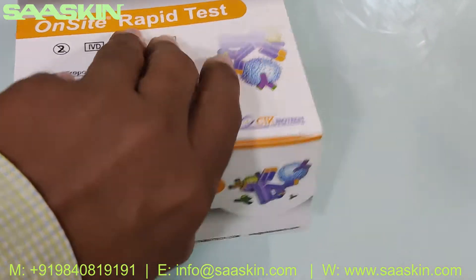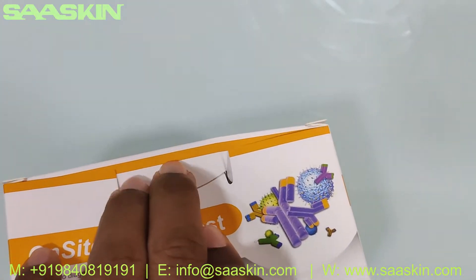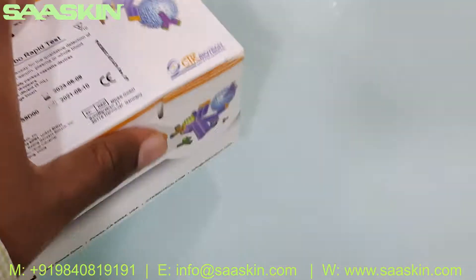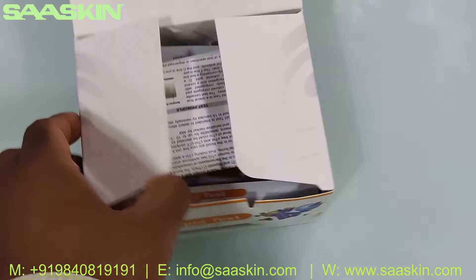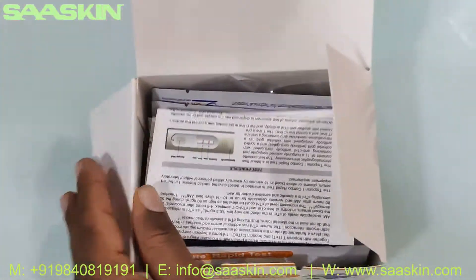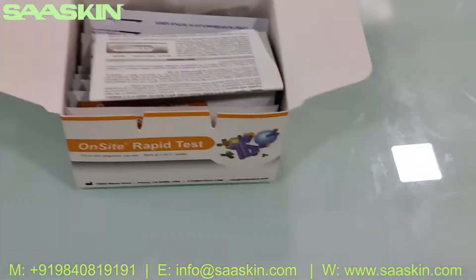Let me open this for you. Okay, I've opened this box. Inside the box, let me just put it in the right way so that the visibility is better.